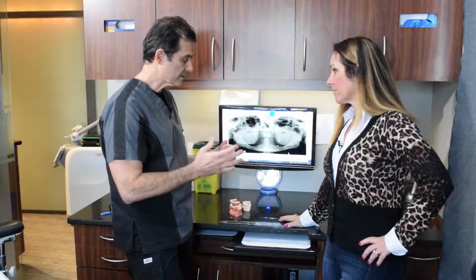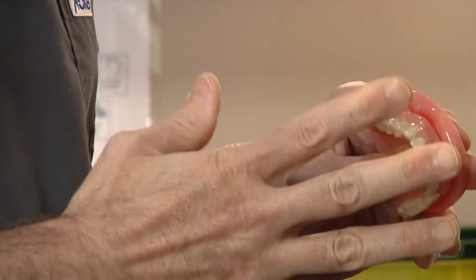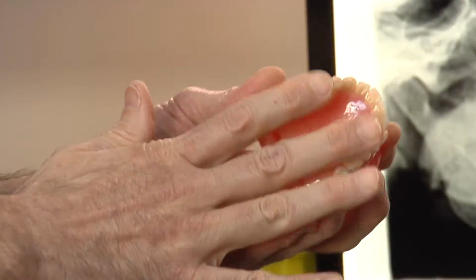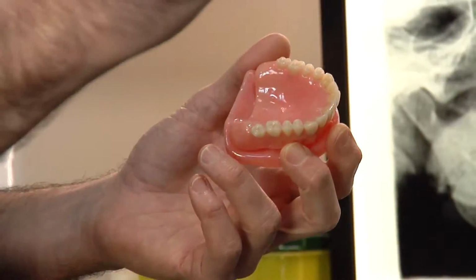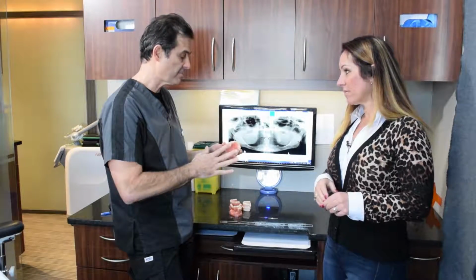And it's important to understand with dentures that, I always say to patients that a denture like this, unsupported by implants, just a denture on its own, is kind of like losing your right arm and getting the hook. Okay, you're not playing baseball. It's not the same as having teeth. It's not the same as having your arm. This is just the best that we can do. It's an inexpensive way of giving you some function back.